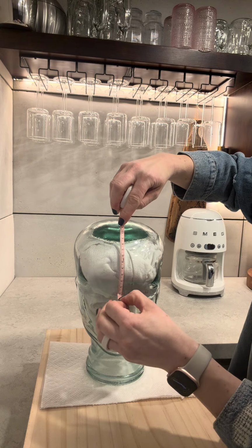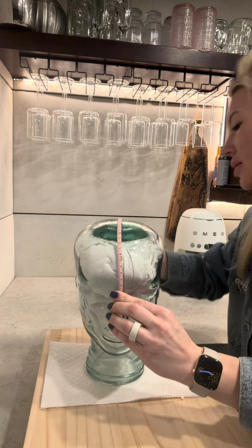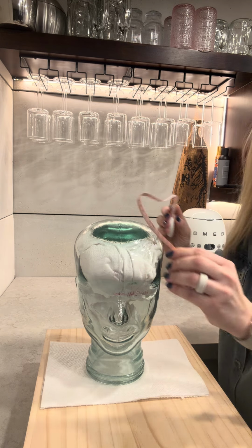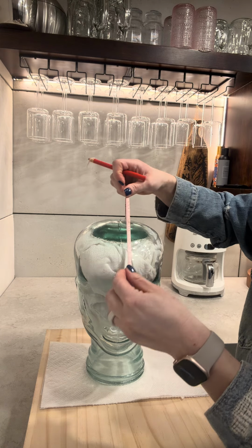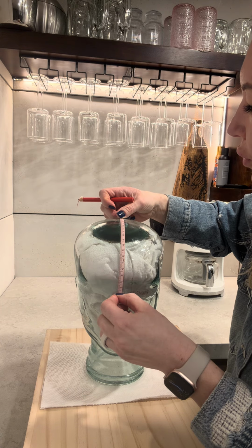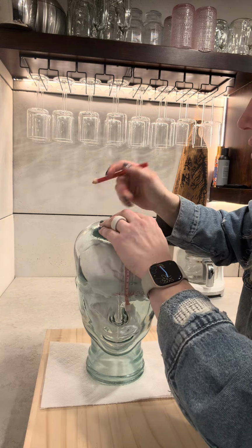from Nasion to Inion. It's 34. So I'm gonna mark Cz by dividing 34 by 2. It's going to be 17.